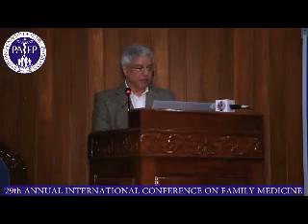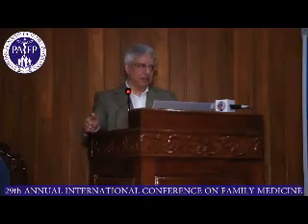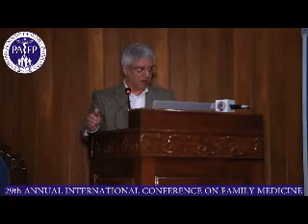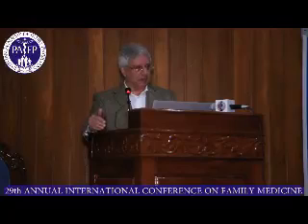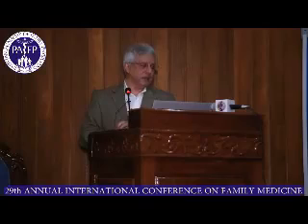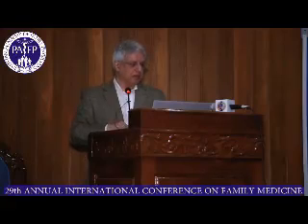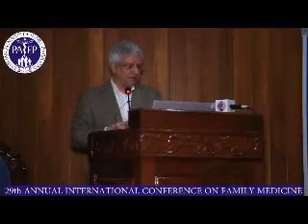But there's a draw between MR and CT when it comes to angiography. So it depends really how the practicing radiologist and the practicing neurologist or neurosurgeons are happy or confident in using one over the other. So you can do either MRA or CTA. Quite a large number of patients would not prefer to have contrast or cannot have contrast for one reason or another. They would obviously have a preference for MRA, and that's where we refer them.